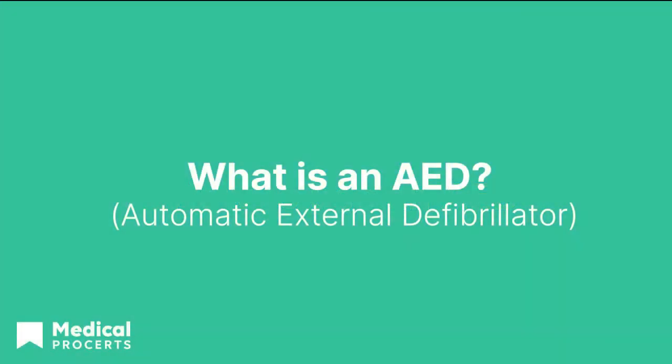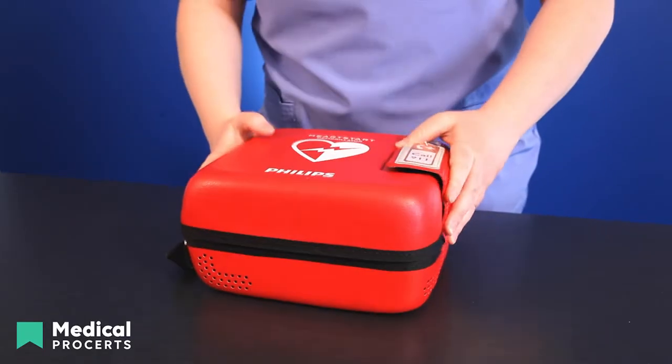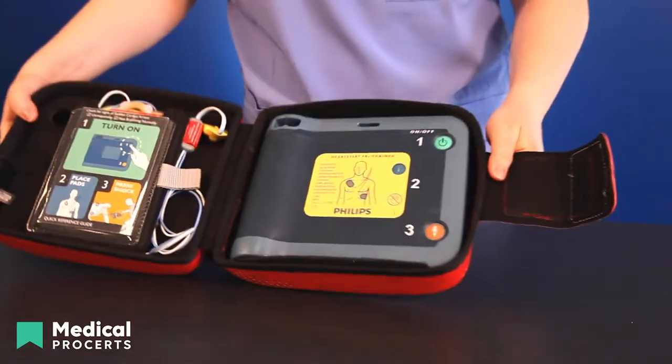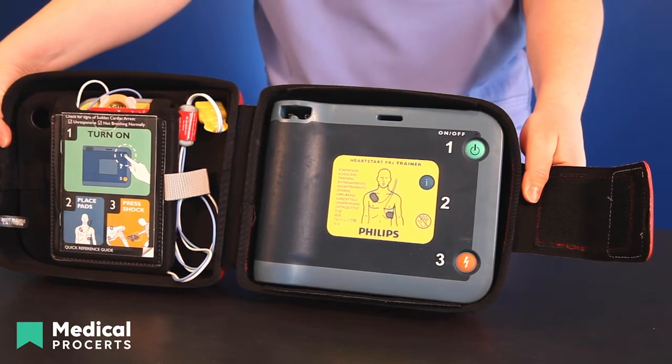An automatic external defibrillator, or AED, is a portable device used on an unresponsive or collapsed person. It delivers a shock to the person's chest intended to restart the heart's normal rhythm. Using an AED with early CPR improves the probability of survival during cardiac events. You can find AEDs in many public spaces these days, so if you find yourself in an emergency situation, an AED should not be too hard to find.